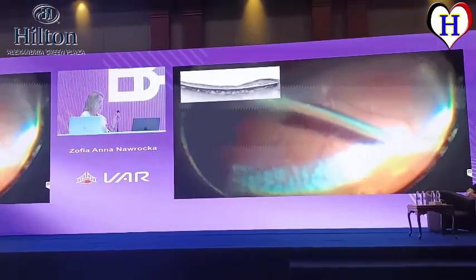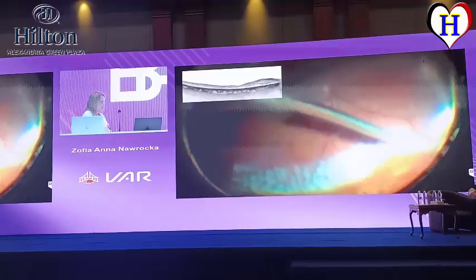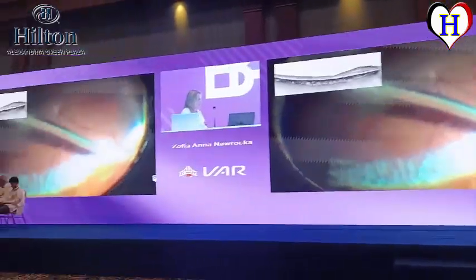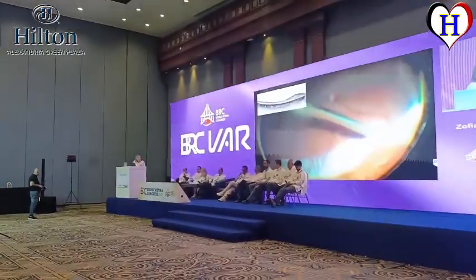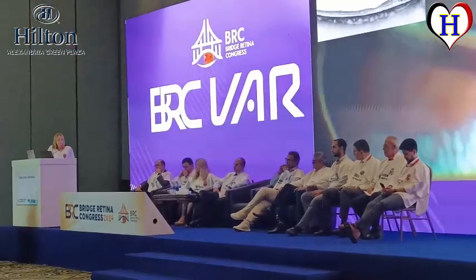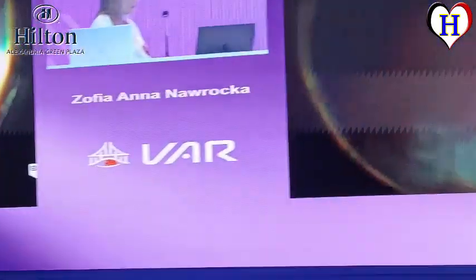Very nice case, Zofia. I think that the hemorrhage came from the choroid, hitting the choroid, not hitting the retina. So you did perfectly in diathermizing the retina in the beginning. That's point one when you plan doing the retinotomy. Point two is always injectable fluorocarbon, because if it happens, it will start going back.